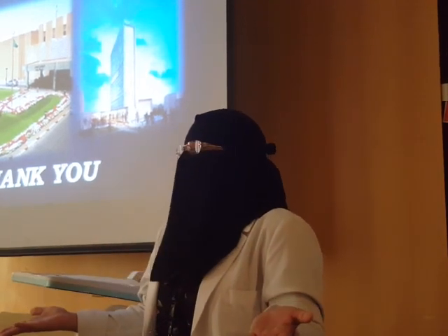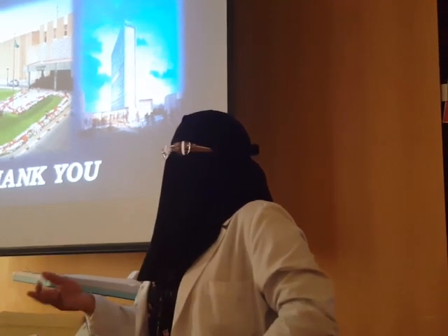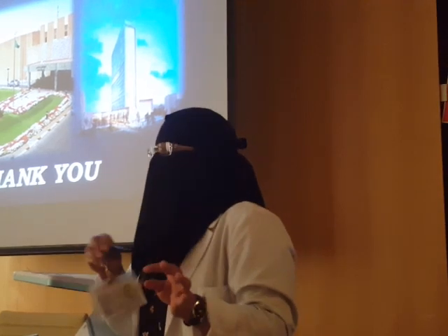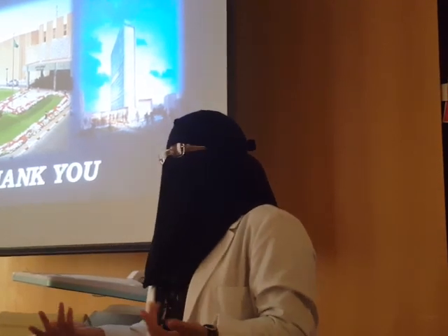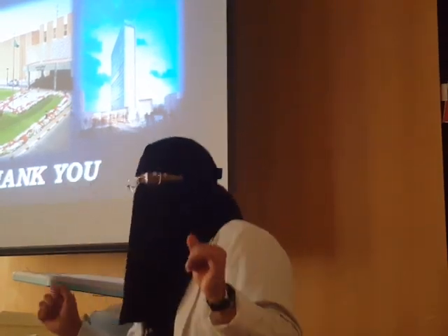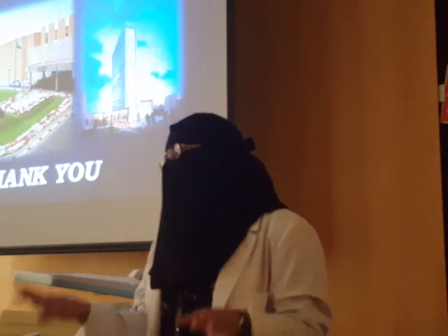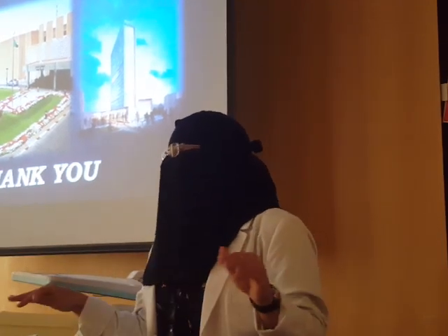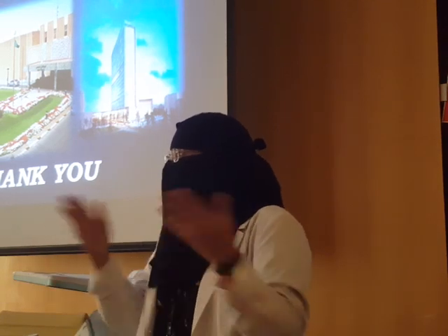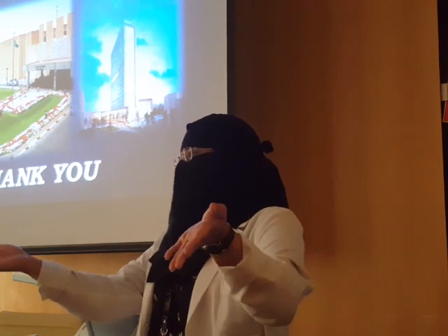If the patient is crying, try to modify it. Sometimes we play music to calm him down. Sometimes we show our badges to calm him down, put him with his mother, to be standing, sitting, or lying down. Do whatever you can to get your information. There is no basic technique or general rule I can give you. Modify yourself to get your information.